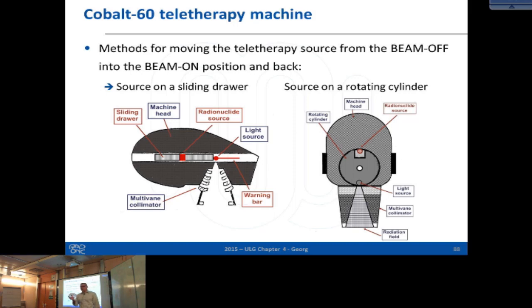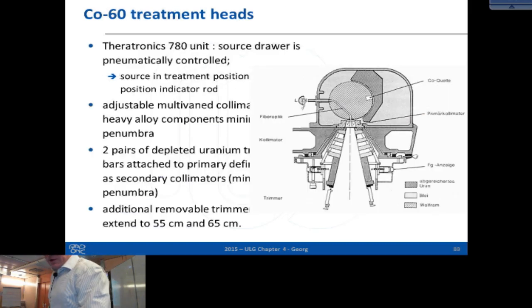You have seen a light field on the accelerator? Yes, no? Yeah? In the same way that you have a light field, meaning a bulb that is really providing light so that you see where the treatment field would be, you also have light fields here with cobalt units.